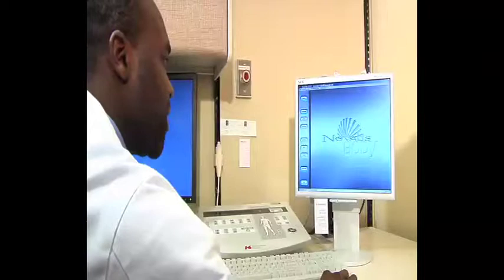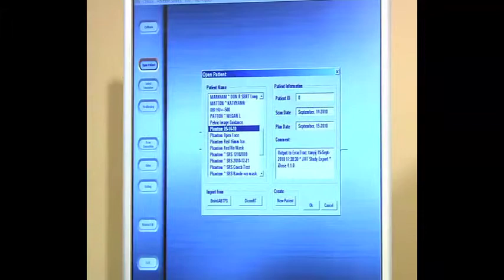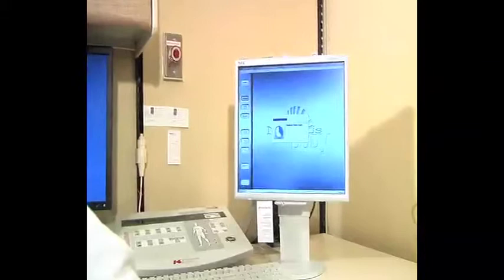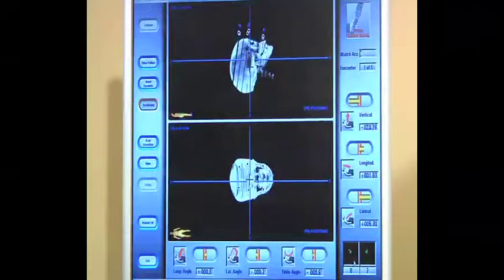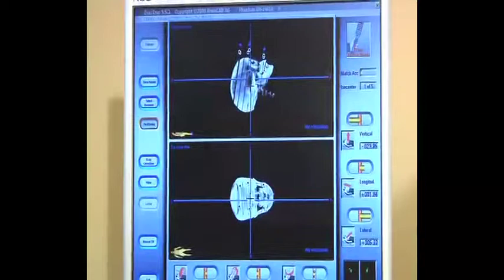I'll open up my patient of interest. Once the patient data is loaded, I'm going to select my isocenter of interest, and once that isocenter is loaded, I'll go into the treatment room and pre-position the patient, either based on laser or the infrared reflective markers.